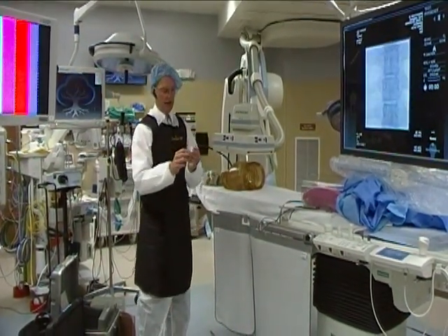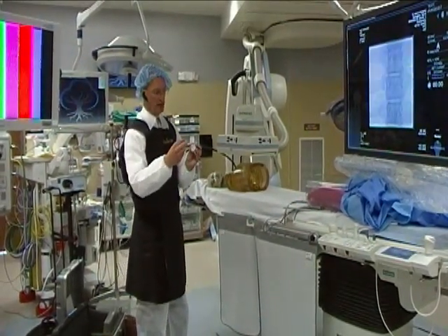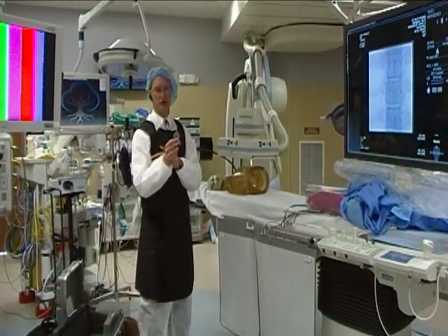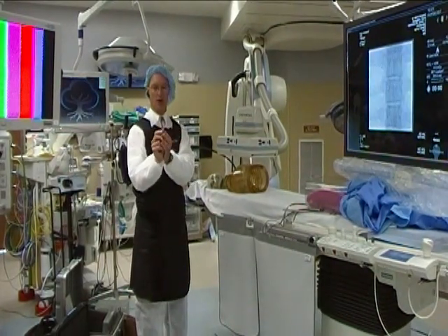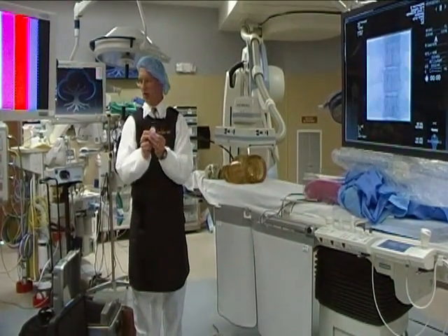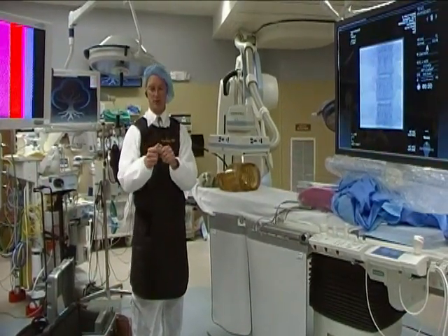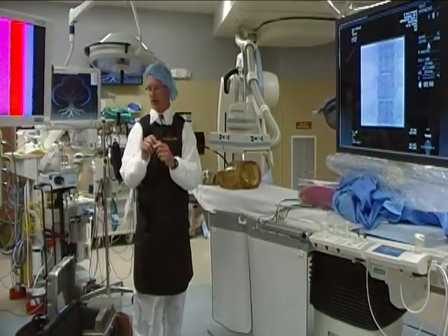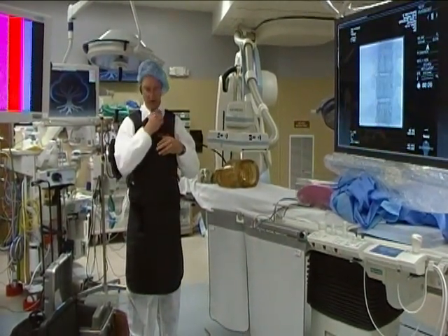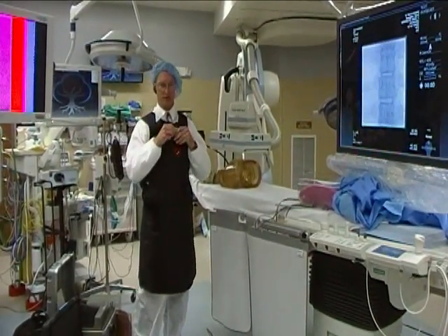The badges are designed to be accurate when measuring radiation coming through the front of it. So you don't want to be having your badge this way. It will read falsely high. If you have it oriented this way through radiation, it'll read falsely low. If you have it this way through radiation, it'll be accurate. And so make sure that your badges are not flipping around on some lanyard where you never know which way they're facing. So clip them to your body, to your shirt, to the front collar, like this would be great. Something so it's going to face the radiation.